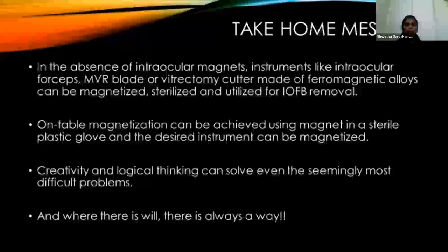Take home message: in the absence of intraocular magnets, instruments like intraocular forceps, MVR blade or vitrectomy cutter made of ferromagnetic alloys can be magnetized, sterilized, and utilized for intraocular foreign body removal. On-table magnetization can be achieved using a magnet in a sterile plastic glove like we did, and the desired instrument can be magnetized. Creativity and logical thinking can solve even the seemingly most difficult problems. And where there is will, there is always a way.